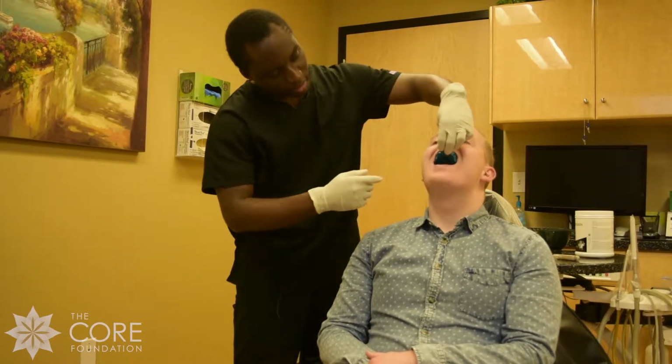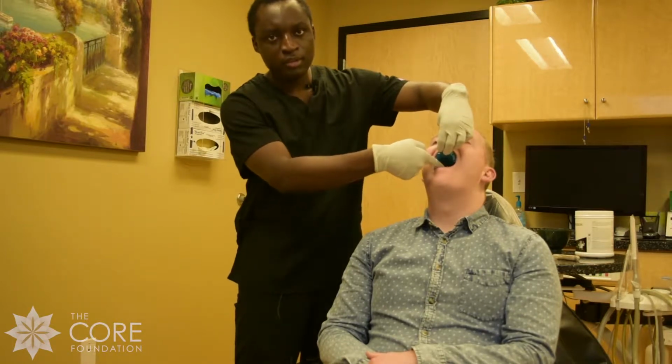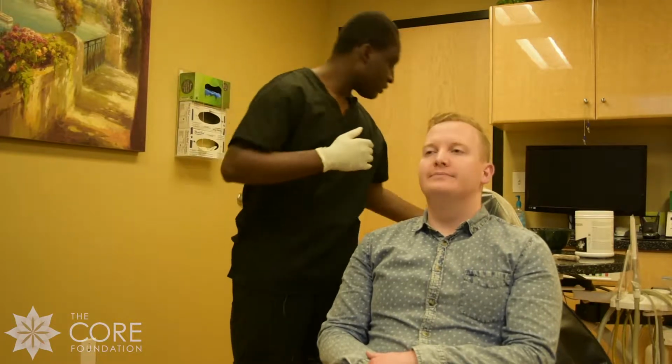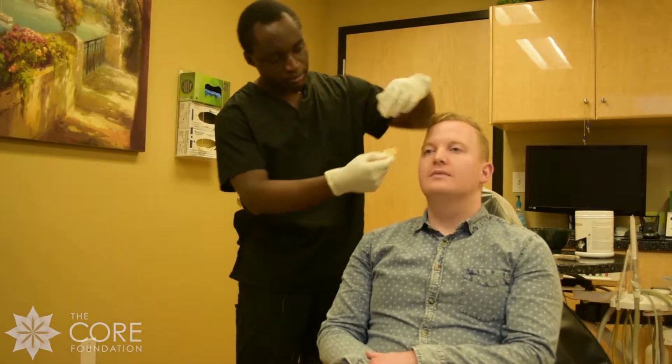Now, the small tray, it would work. What I'm noticing is it's not covering up his molars. So if we take it, it will just take the impressions up to the canine, and you need the molars in any impression. So we'll go ahead and go to our next size, which is medium.